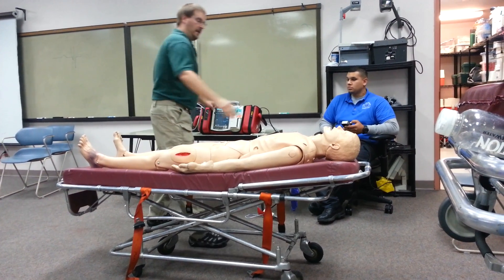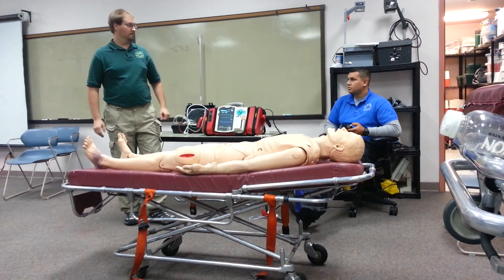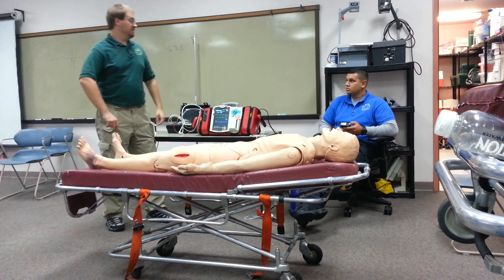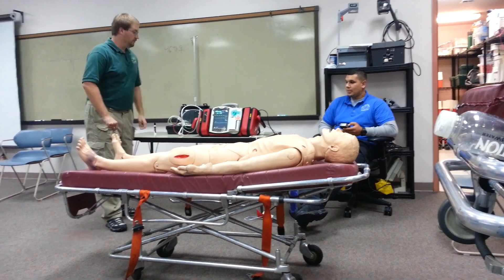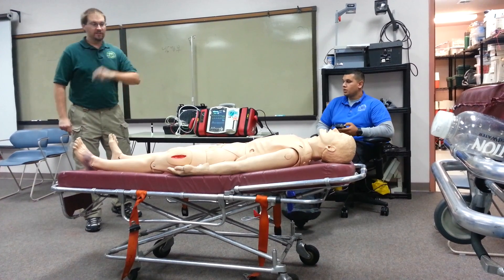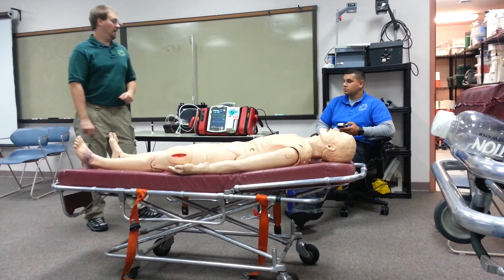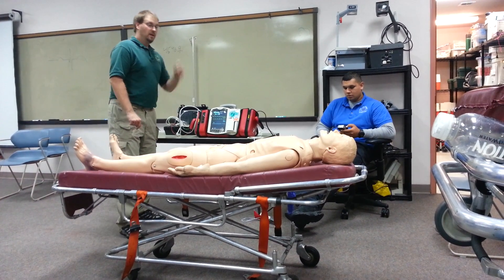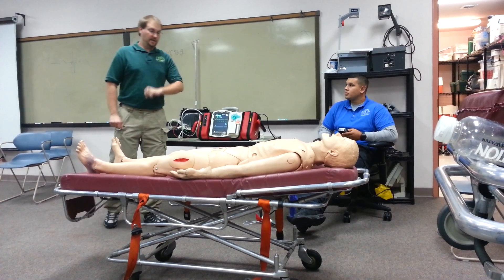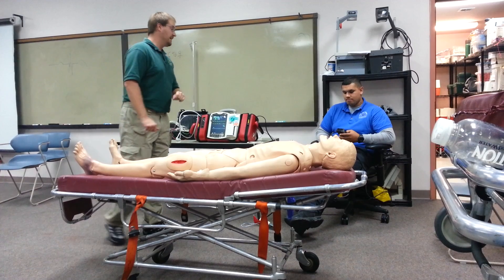We're doing CPR and bagging. ABCs are taken care of. I'm checking the monitor, verifying there is in fact no pulse. I have pulseless electrical activity. We're going to continue chest compressions and attempt to rule out the 5 H's and T's. Someone get a blood sugar. Let me know when it comes back and let me know if bagging becomes difficult. Once the IV is in, administer 40 units of vasopressin IV push and have epinephrine ready. Continue CPR for two minutes.